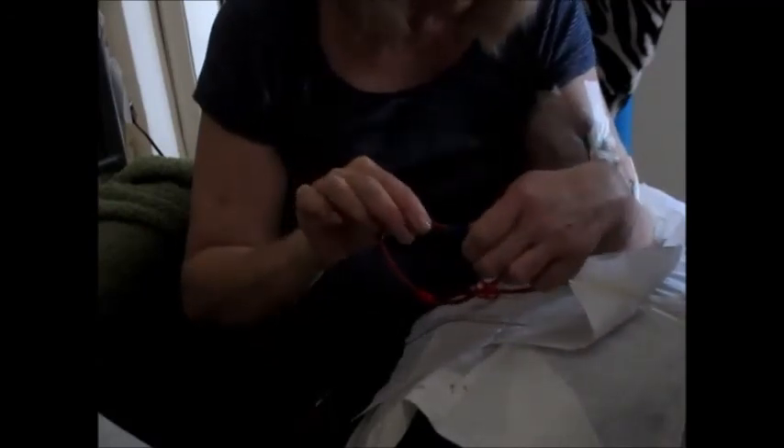Now I'm removing the rinse connector from the venous line and connecting the venous line up. Always make sure the lines are clamped and unclamped correctly. I'm now starting the process of dialysis — the machine will ask me to confirm to start the blood pump, and once my blood has been detected, dialysis will have commenced. Then I'll be able to insert my anticoagulant through the venous port, which stops the blood from clotting as it goes around the extracorporeal circuit — pumped outside your body.